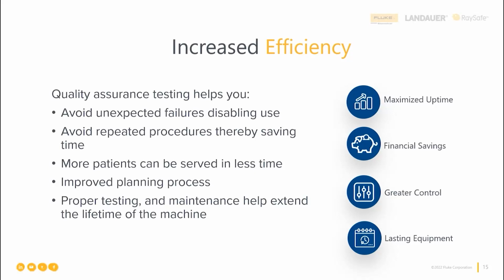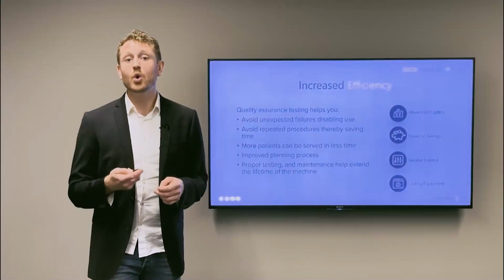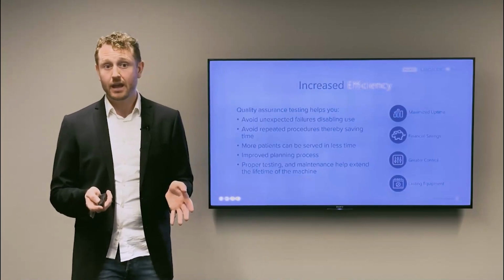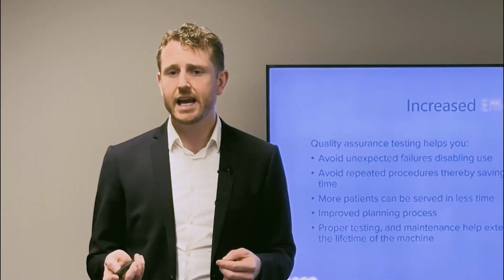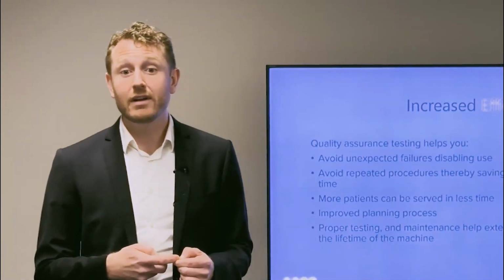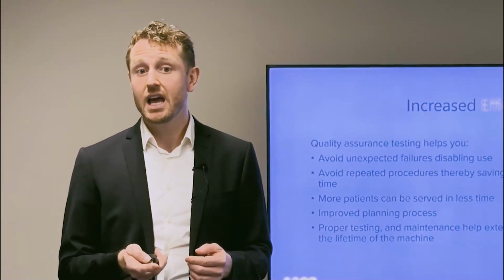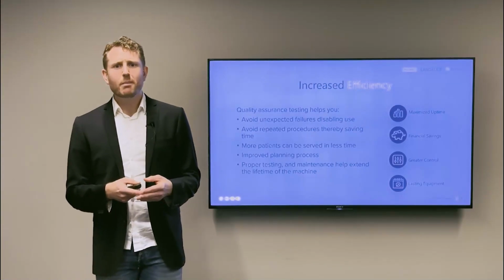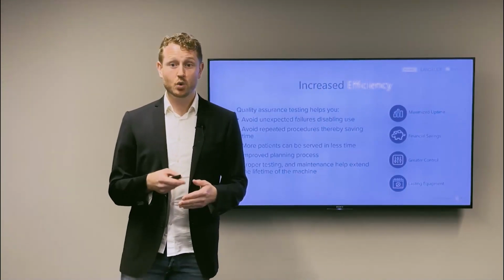If one has a proper knowledge about the aging of the X-ray machine, one can more easily plan for maintenance, heavily increasing its uptime. If the machine unexpectedly breaks, it may take a long time for it to be repaired, and it will heavily affect the number of patients treated, and in some cases, also the income of the medical facility. Aging machines may also affect image quality.